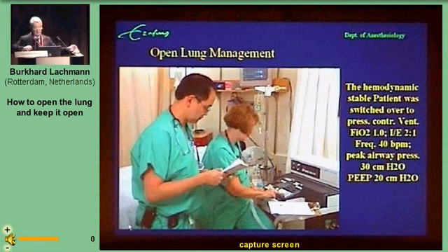Okay, we've done that. Okay, then just wait 20-30 seconds and please tell me what the saturation reads and what is going on with the arterial oxygen tension.